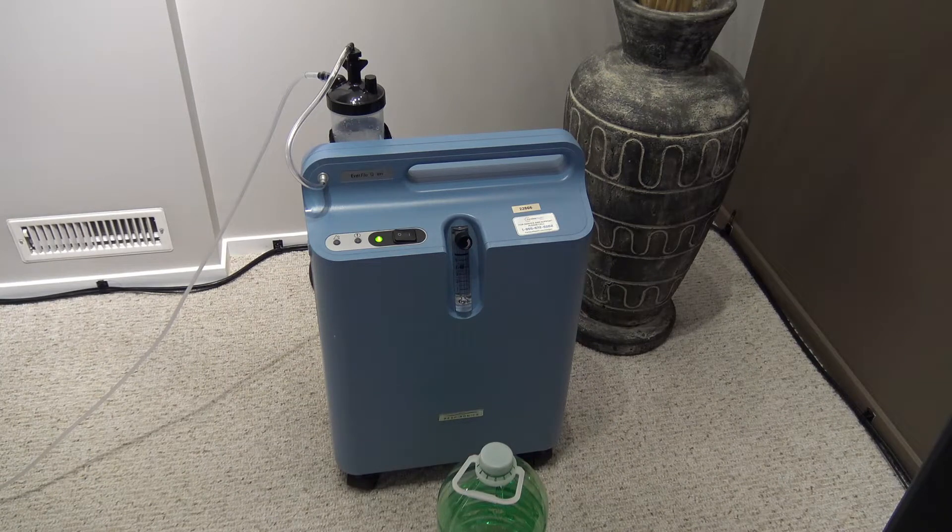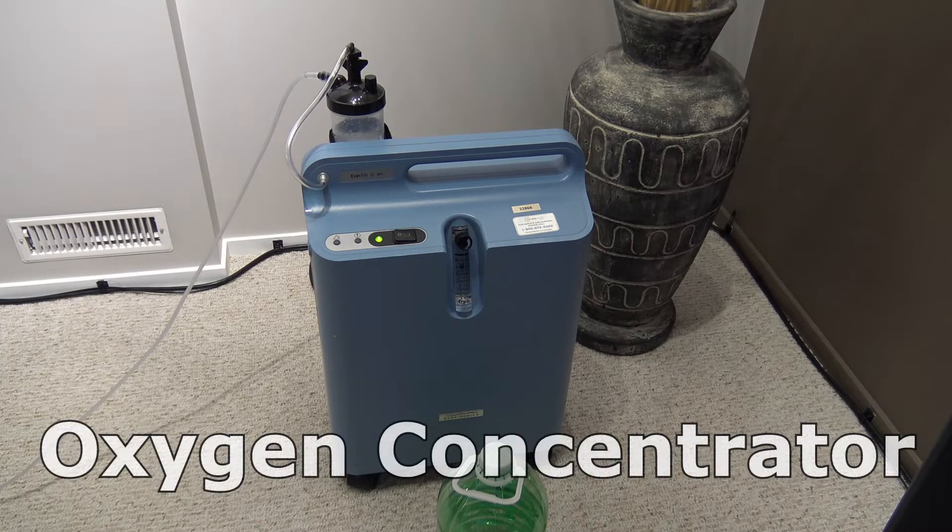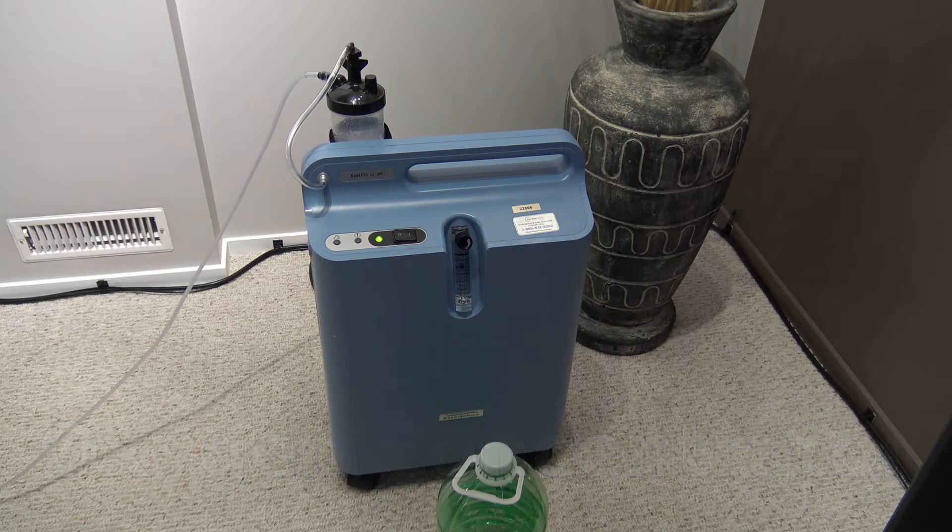This is my oxygen machine. You can see that black lid in a clear bottle — that's a humidifier. It puts out moist air so it doesn't dry out your nose. You don't end up with nosebleeds. It makes it much more comfortable to breathe the air coming out of the machine with it humidified.